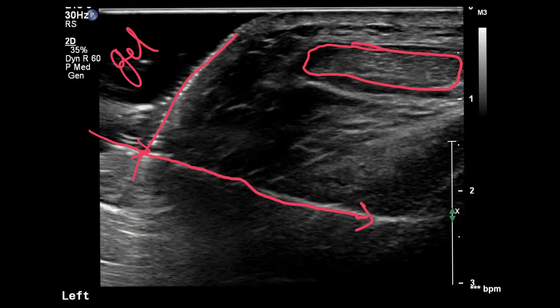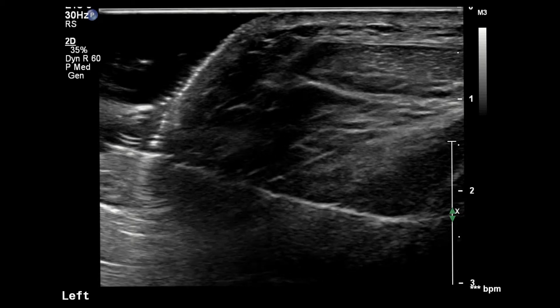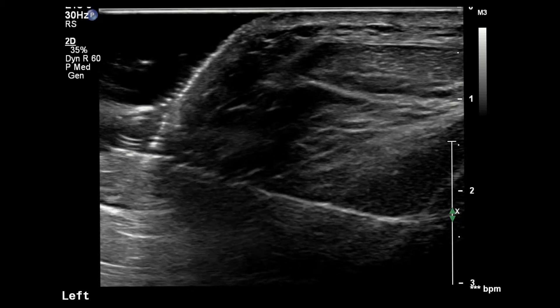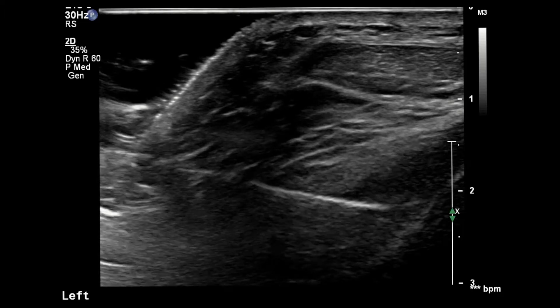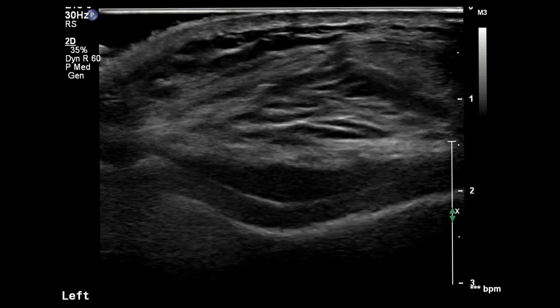With this approach, if you are the kind of person who likes to see fluid moving, I would encourage you to move your transducer to the medial or lateral gutter, or to move up to the suprapatellar pouch, where you're more likely to see air bubbles.